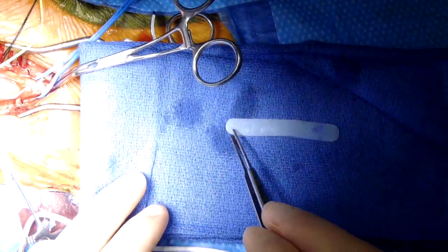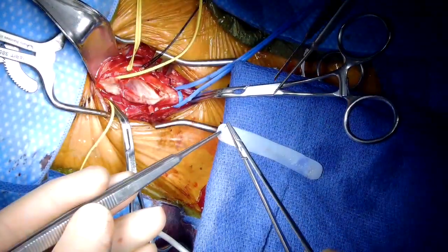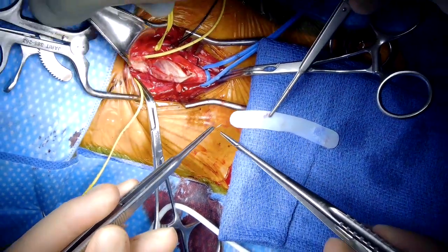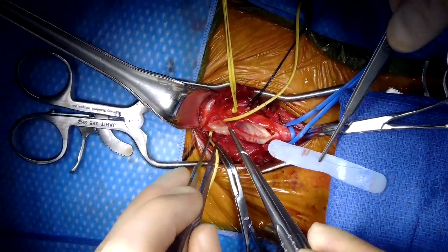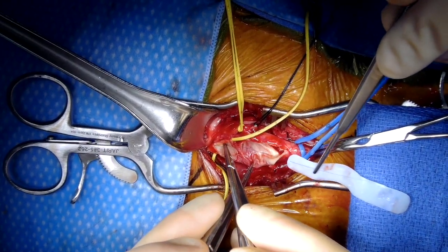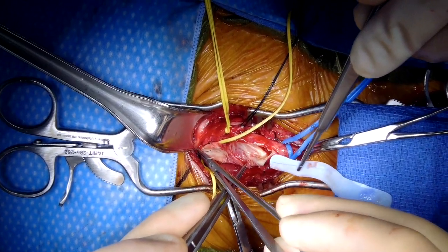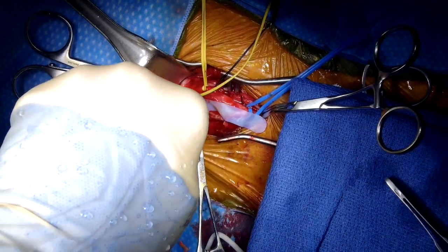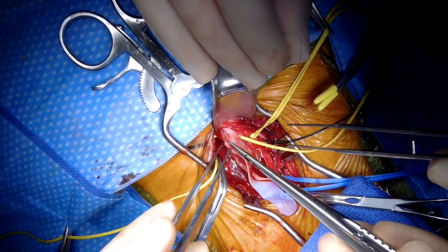A bovine pericardial patch was brought onto the field, noting to place the smooth side of the patch on the intraluminal side of the vessel. The patch angioplasty was performed by initiating a 6-0 running Prolene suture on a BV needle from the apex of the internal carotid artery, running towards the midpoint of the arteriotomy on both sides. The suture was followed by the assistant in order to allow the patch to be snugly opposed to the artery wall with no redundancy in the bites.